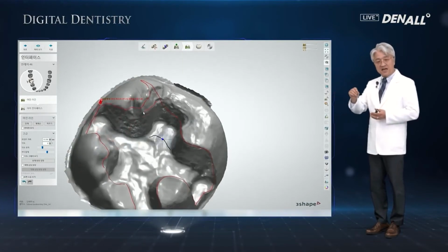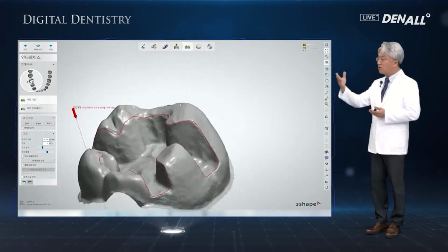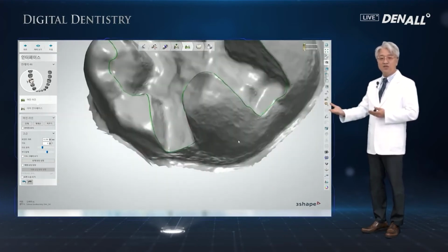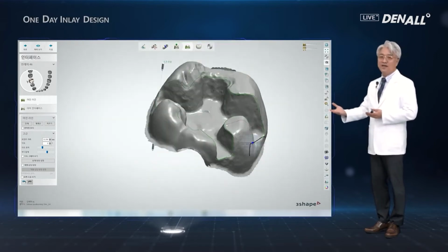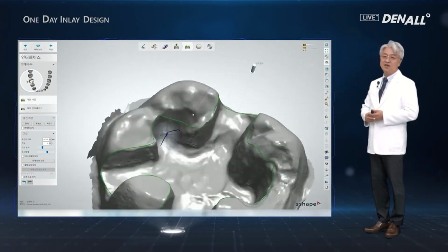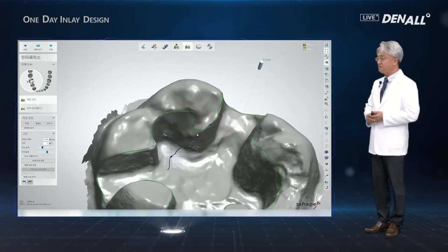And if I do this process myself, then I can also do the prep much better. So the preparation, I think, has gotten better thanks to the CAD-CAM because I start with the CAD-CAM first. Using hand pieces has become better for me also. So I think using CAD-CAM has been very useful and helpful for me.